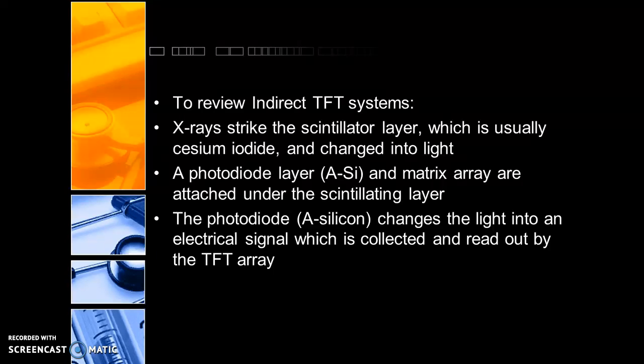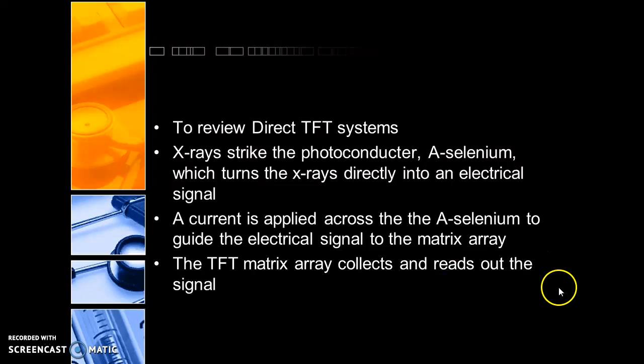And again, there's a lot of different ways to say that. The matrix array, the thin film transistor array, the TFTs. So be on the lookout for a lot of different words that are basically in reference to the matrix. So when we're talking about image quality and spatial resolution and matrix and pixel size, when you're thinking of direct systems, that corresponds to an actual physical piece of machinery, which is a single individual thin film transistor, sometimes also called a detector element, or DEL. That's more vocabulary that you definitely want to know.